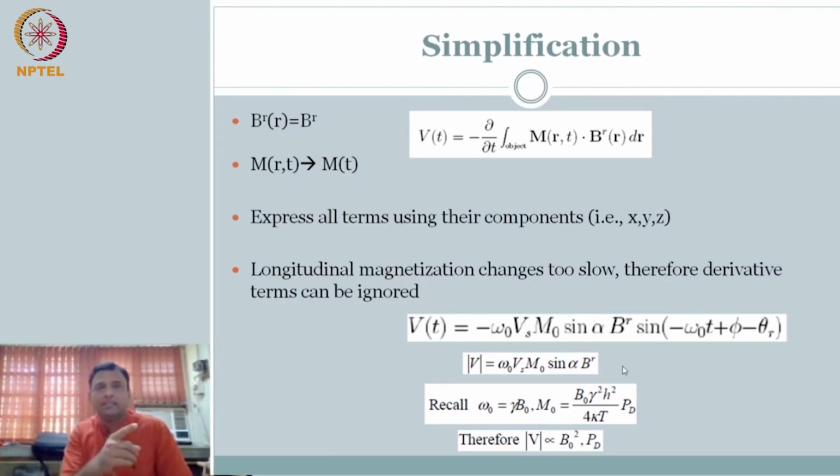What was alpha in our thing? If your magnetization vector was on the floor, then you'll get the maximum signal. That is what it says. So we started with some alpha as arbitrary. If you can make this alpha go to the floor, that is 90 degrees, then you will get the best signal. So the idea is, how do we manipulate this alpha?